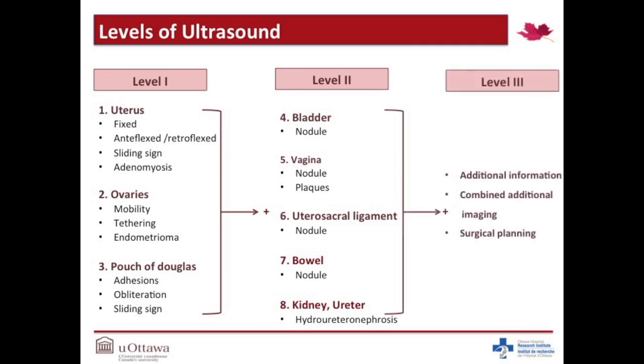When a level 2 scan is positive for disease involvement, a more advanced imaging is usually performed by an expert radiologist in the field of endometriosis. This provides us with a detailed assessment of lesions in terms of size, site, depth of infiltration, distance from anus or trigone that helps a surgeon in preoperative planning.